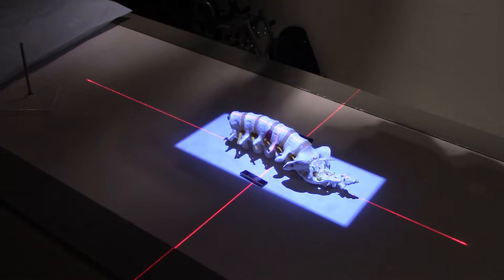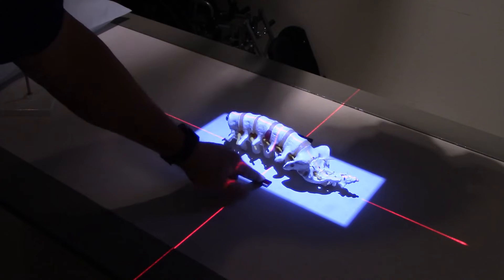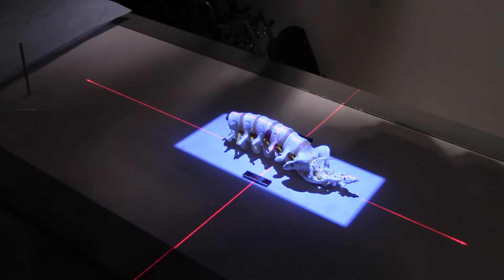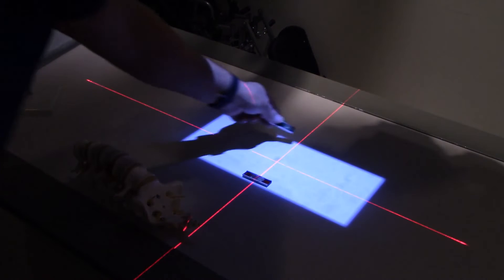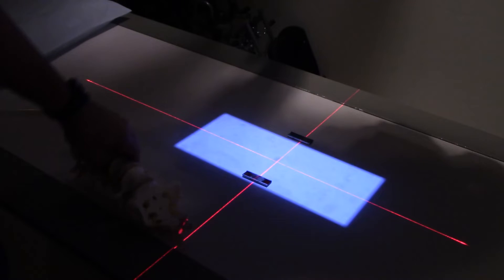So here is just a piece of junk lumbar spine — not a radiographic model, just one that shows where the nerves and nerve roots are. It's a little teaching model, not necessarily designed to be X-rayed, but for our purposes it will work. You see where that right marker is? It's in the light field — outside the anatomy but inside the collimated field. On the other side of the spine we have a left marker, and the left marker is just barely outside the collimated field.